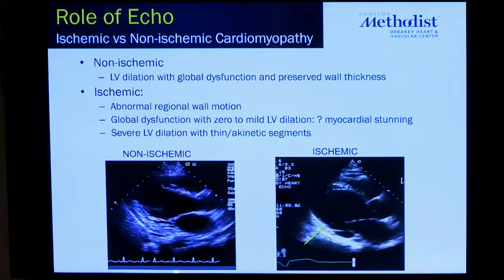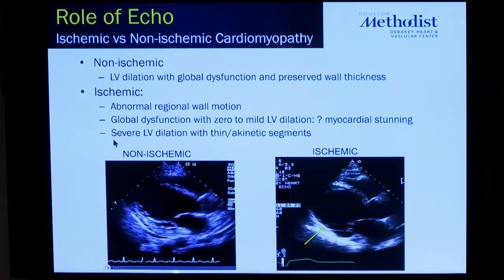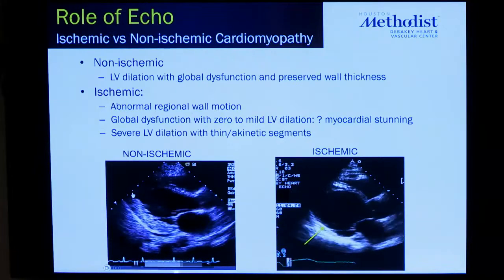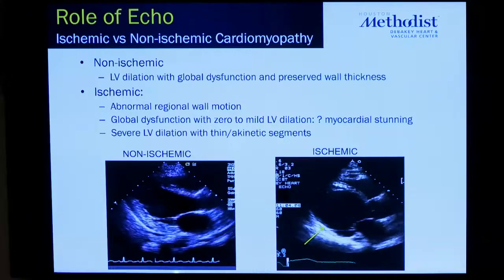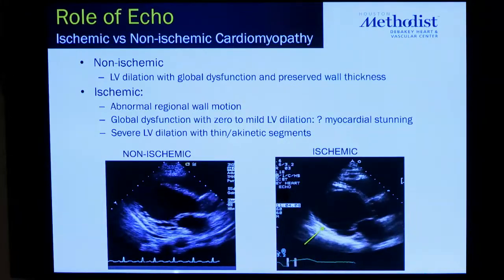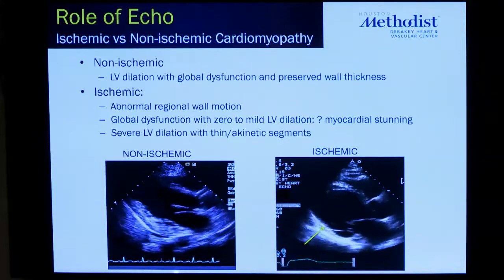So again, even wall motion abnormalities, although they point to CAD quite often, occasionally can be seen in other diseases. Likewise, the one that we're calling non-ischemic, it's likely to be non-ischemic, but it could also be, as Dr. Zogby showed earlier, a coronary artery disease patient with stunning, could be a left main, for example, showing a reduced function but viable myocardium.